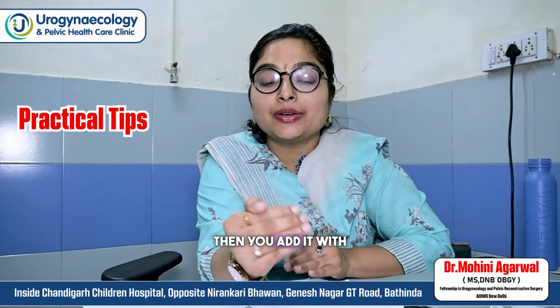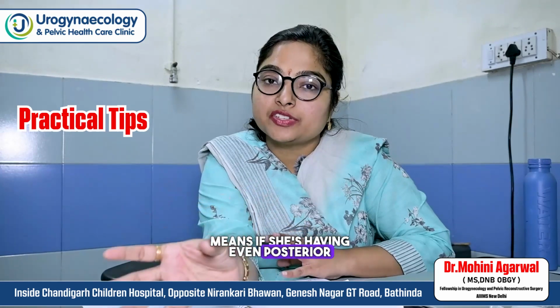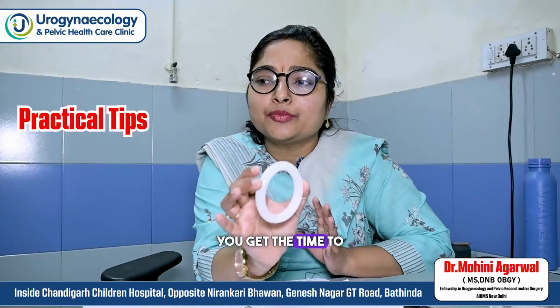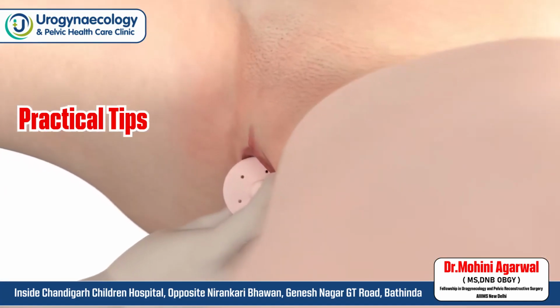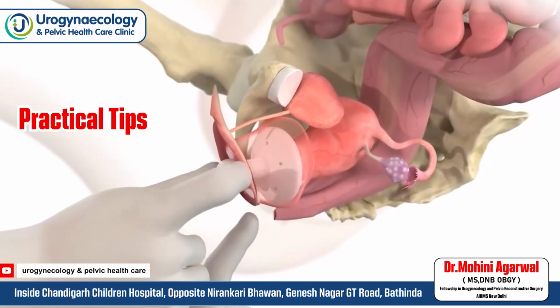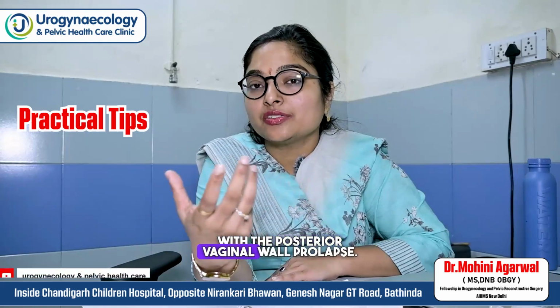Then if compliance is good, you add support. There are ring pessaries with support. If she is having uterine prolapse with posterior vaginal wall prolapse, then also you first insert the ring pessary. You can see the compliance. You get the time to see how the patient comes for follow-up, what her concerns are, and whether the pessary suits her. Then in those cases, uterine prolapse with posterior vaginal wall prolapse, you can offer her the Gellhorn pessary. So first you choose a ring pessary, then a ring pessary with support, and then you shift to the Gellhorn pessary for posterior vaginal wall prolapse.